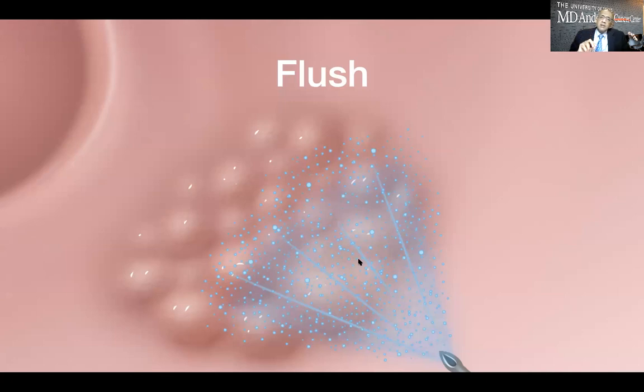So by asking the needle to be flushed, there are two advantages. One advantage is you know that your needle is primed, so no question of injecting air. The next thing is, by injecting, you would know where the fluid moves. And if the fluid moves away, you know that your lesion is not dependent, and that's where your lesion should be.